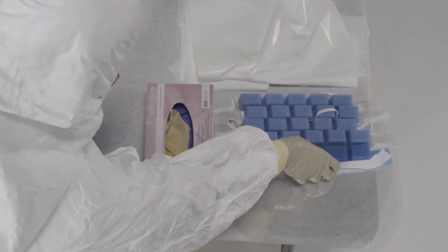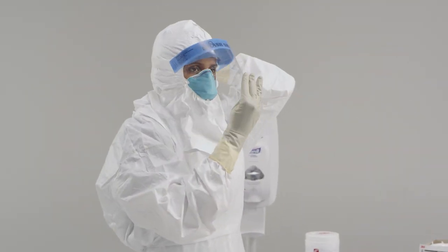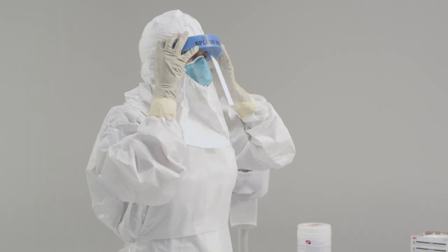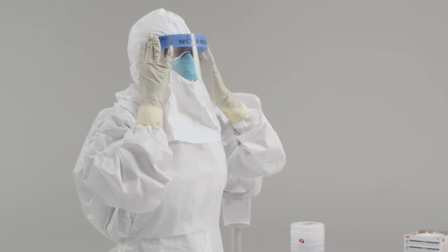Next, you're going to put on your face shield. In order to do this, you're going to have to bend forward slightly. With the face shield facing towards you, take your thumbs inside the elastic straps, placing the foam on your forehead and stretching the elastic band and placing it behind your head. Once the shield is situated, check to make sure it covers the front and sides of the face, and no areas are left uncovered.